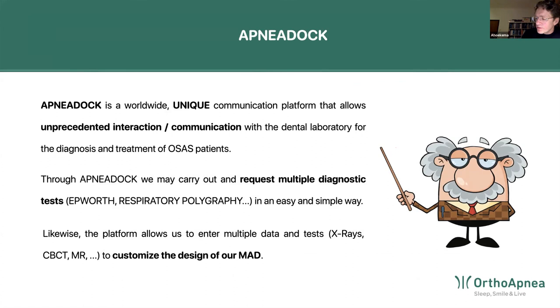It's a question whether it is possible to integrate retention for elastics in addition to the vertical shim that is incorporated in the NOA. Can you also add vertical elastics? So I would say to minimize even further mouth opening, is that possible? Well, we don't need elastics.